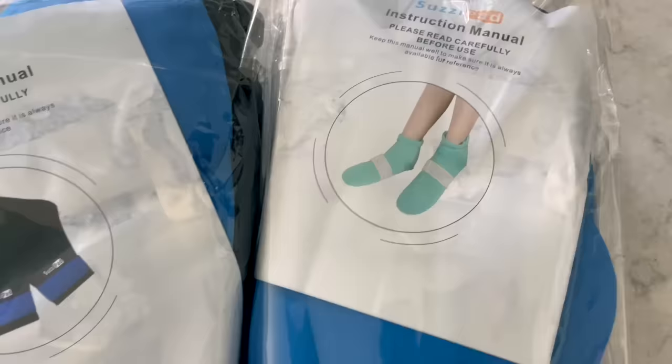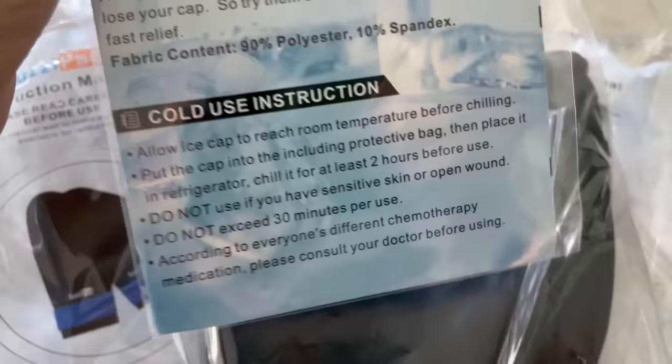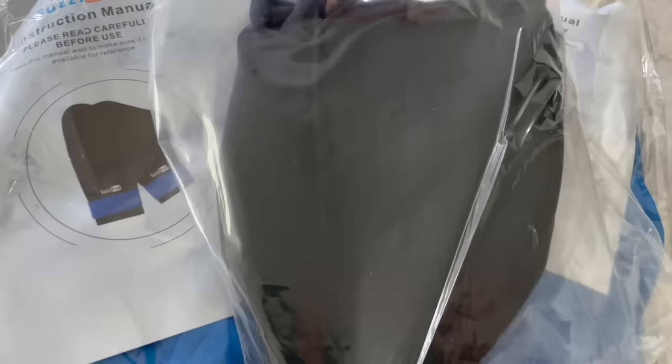And then we have the cap. This is what I haven't tried yet, so I will be trying this at my infusion on Thursday. Both the cap as well as the mittens and the socks come with all of the instructions you need to properly care for the ice packs and use them.